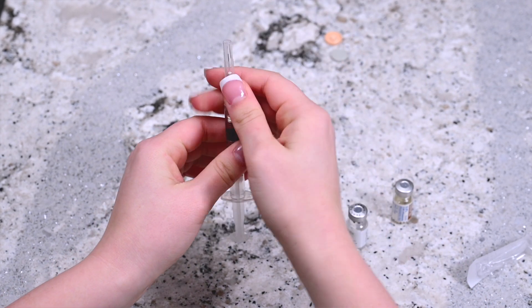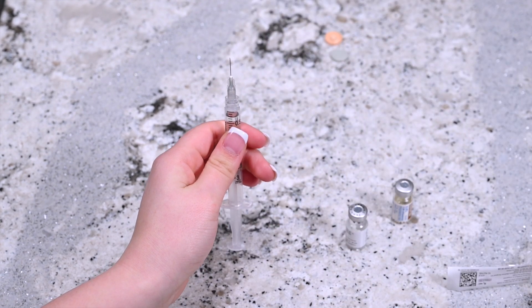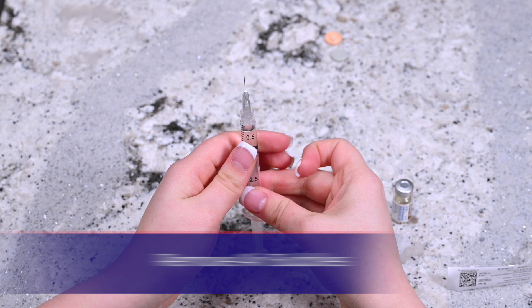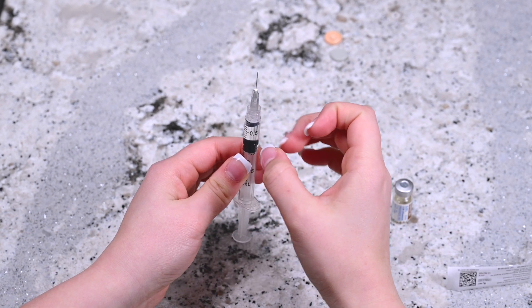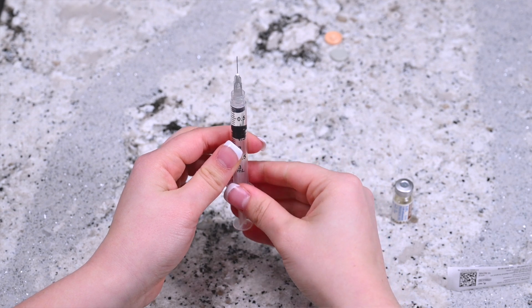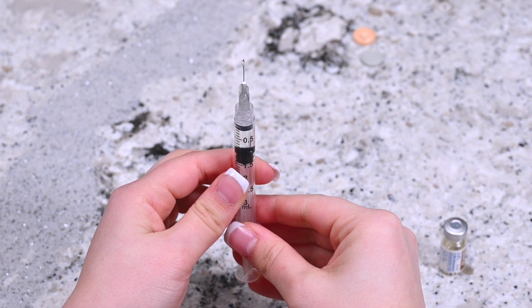Hold the needle upright and remove the cap. Don't let the needle touch anything, including your hands. While holding the needle upright, gently tap the side of the syringe until the air bubbles migrate to the top. Apply slight pressure on the plunger until a drop of liquid appears at the tip of the needle.